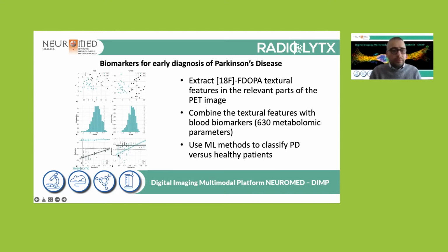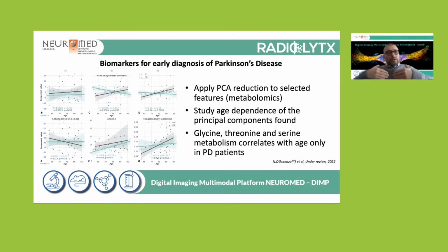And to be intellectually honest, I also added the statistical evidence that the model is not overfitting on the right, while the model on the left may be overfitting. So it is possible to strongly distinguish between them.